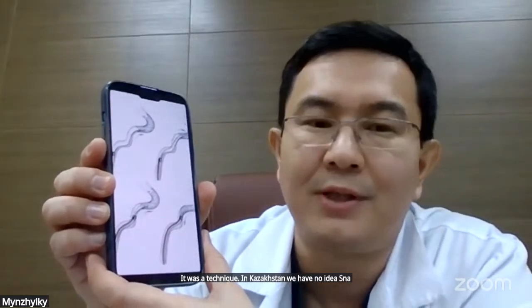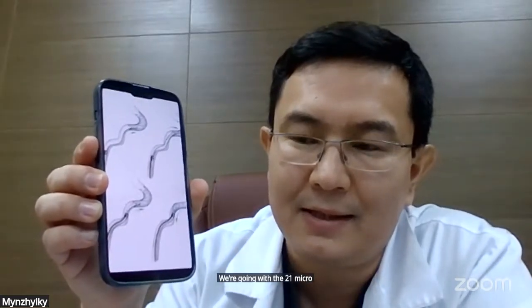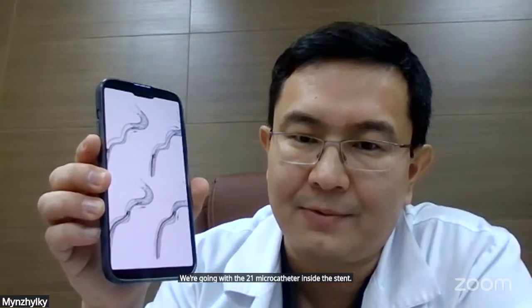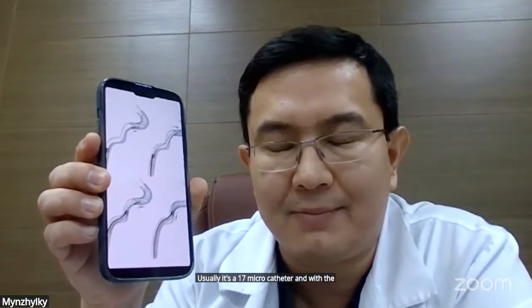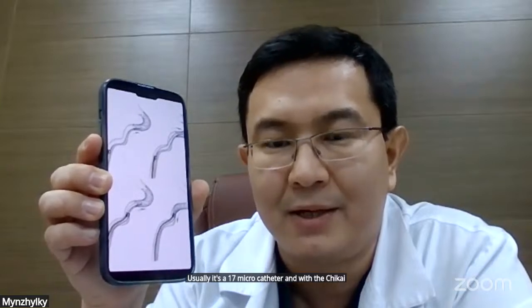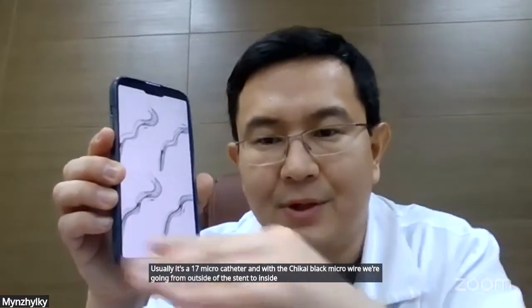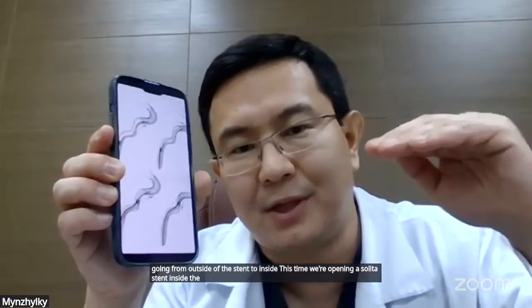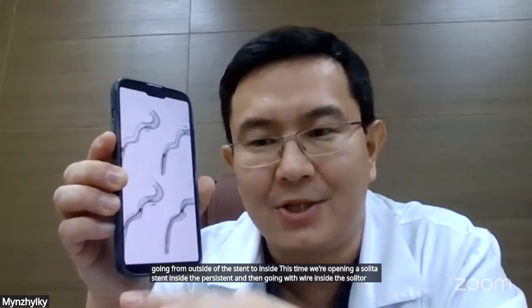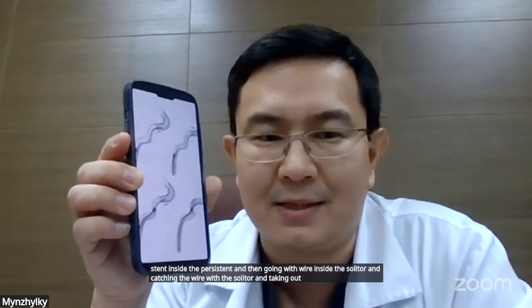In Kazakhstan, we have no snares. That's why we are using the Solitaire stent. We go with a 21 microcatheter inside the stent, and then we go with the second microcatheter, usually a 17 microcatheter with a Chikai black micro wire, from outside of the stent to inside. At this time, we open a Solitaire stent inside the first stent, then go with the wire inside the Solitaire, catch the wire with the Solitaire, and take out both microcatheters at the same time.